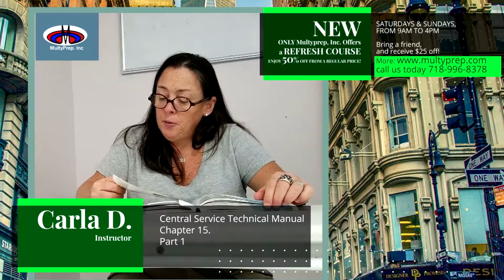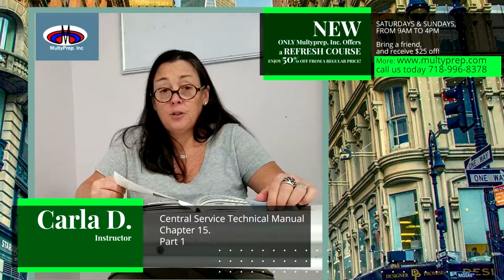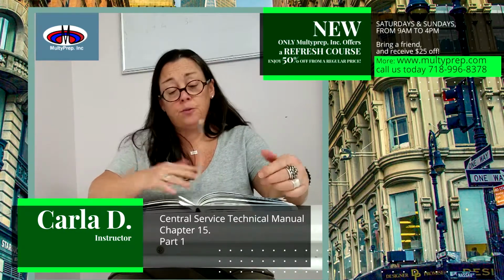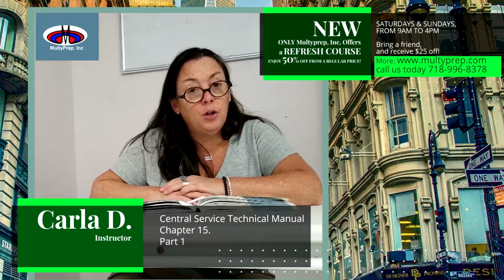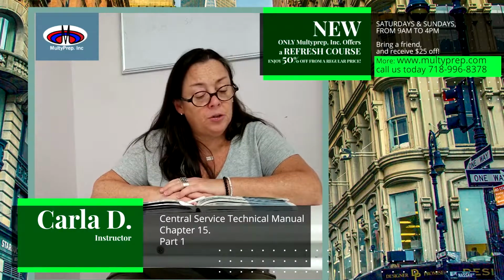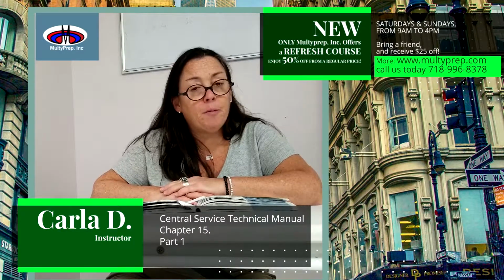To minimize the safety risks associated with the use of ETO, employees should be instructed about hazards of ETO, sterilizer manufacturer and ETO suppliers' instructions for use, processing procedures, storage and handling of ETO gas cartridges, procedures to reduce employee exposure, use of PPE, principles of ETO monitoring and interpretation of results, handling canceled cycles, applicable OSHA standards, safety data sheets or SDS, ETO emergency plans.